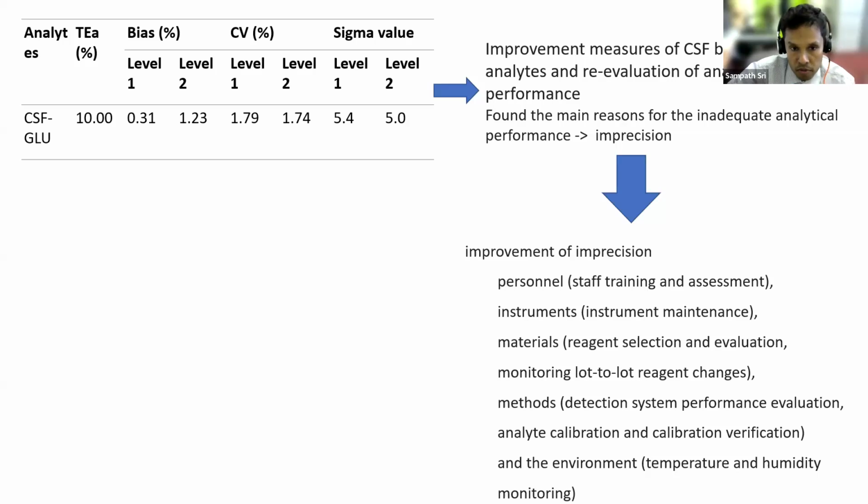Then they improved their instruments by instrument maintenance and so on. Then they changed the materials: reagent selection and evaluation was done for monitoring lot to lot variations and the other things. Then they selected a method, and then they even addressed environmental factors like temperature and humidity monitoring.